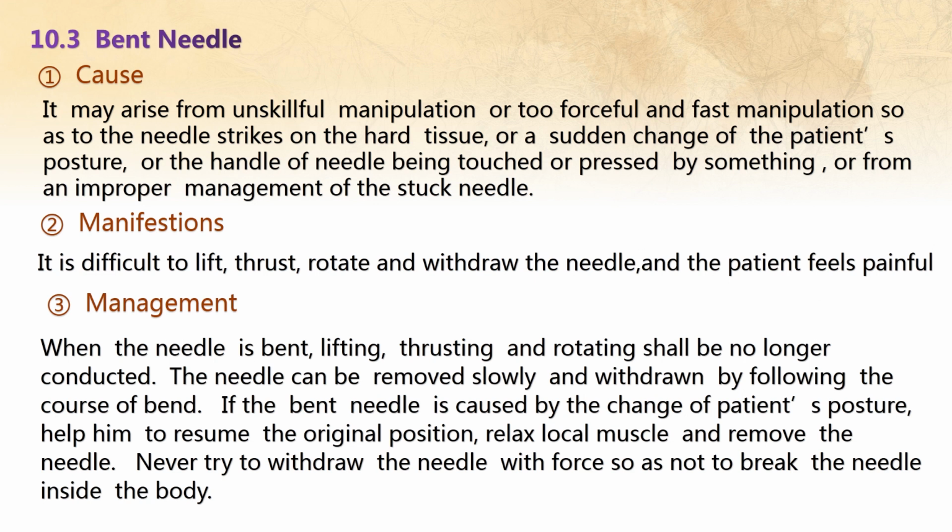Management. When the needle is bent, lifting, thrusting, and rotating shall be no longer conducted. The needle can be removed slowly and withdrawn by following the course of the bend. If the bent needle is caused by the change of the patient's posture, help him to resume the original position. Relax the local muscle and remove the needle. Never try to withdraw the needle with force so as not to break the needle inside the body.